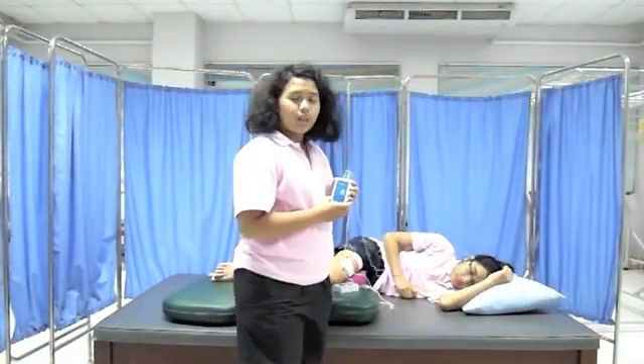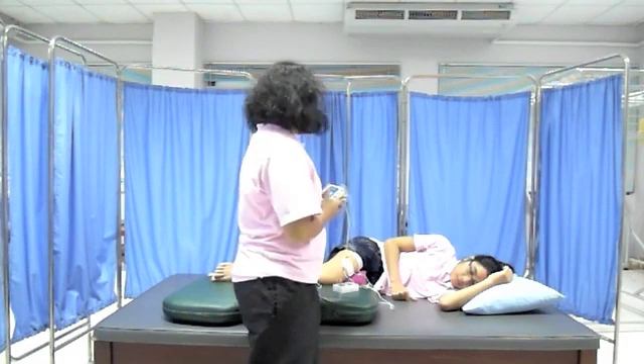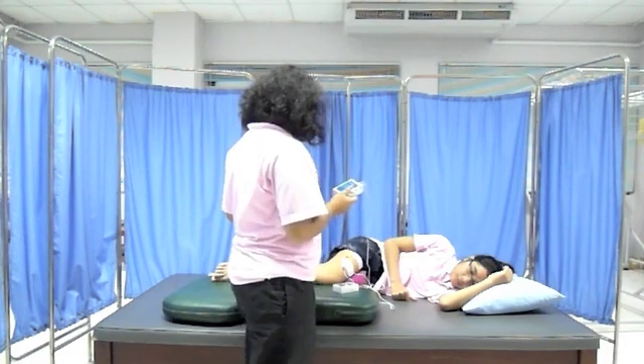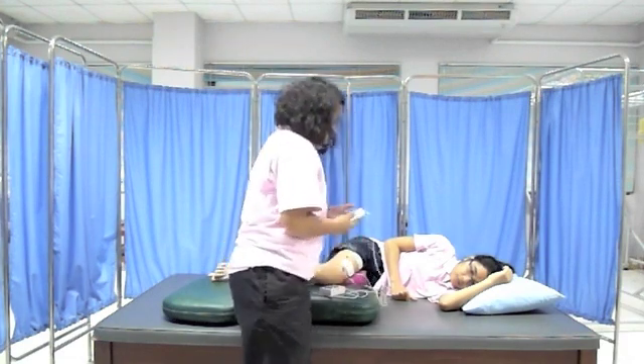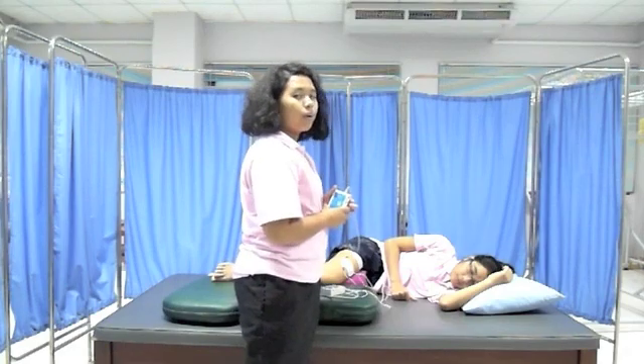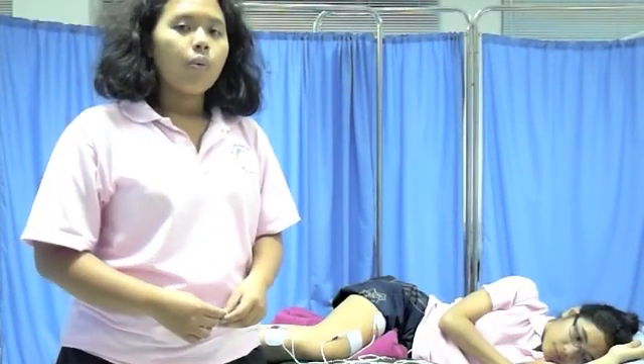In this case, we use both channels on the muscle. In the first channel, we use the gluteus, and in the second channel we use the quadriceps. We also use one channel for the tibialis anterior. Before we have the patient walk on the floor, we should check the movement of the leg on the side first.